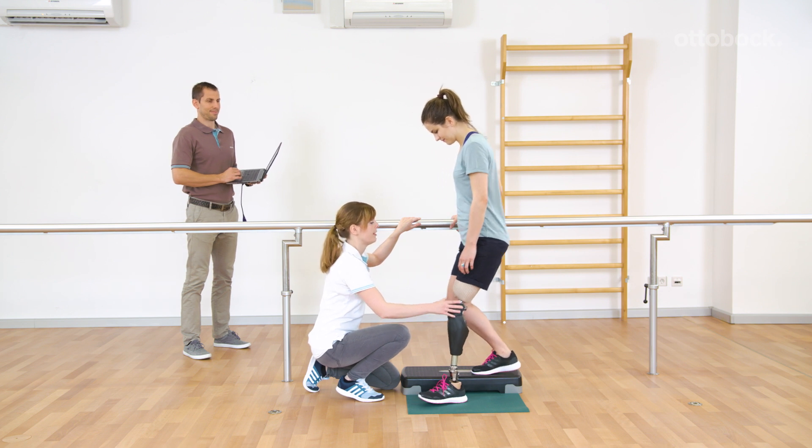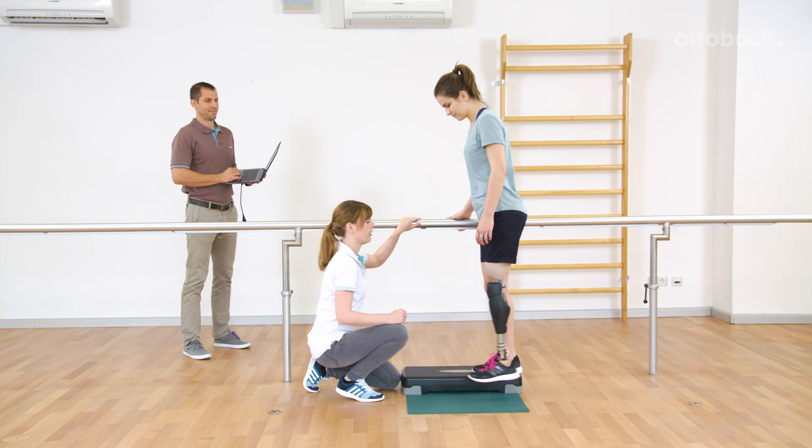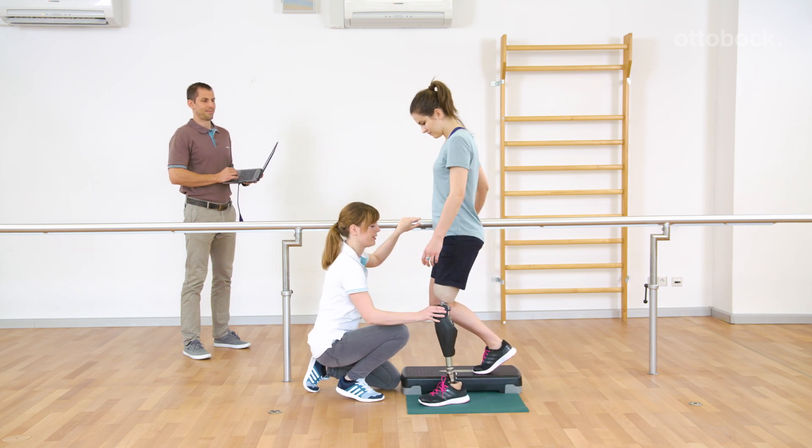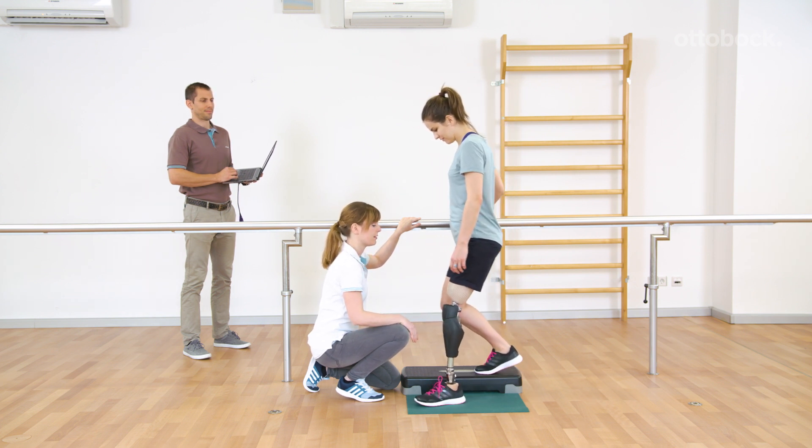Reka trains to block the knee joint in different flexion angles. She notices that the joint blocks in the flexion direction once she loads the prosthesis, and thus she can fully trust it.